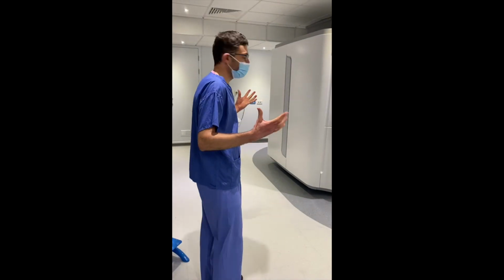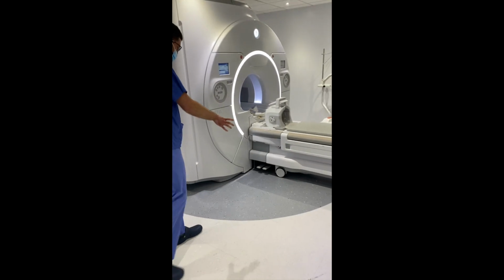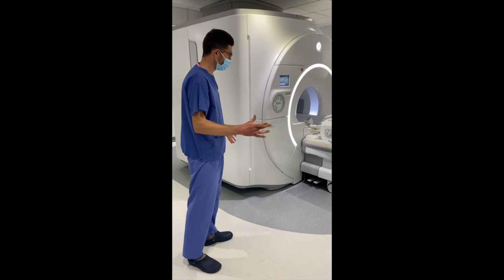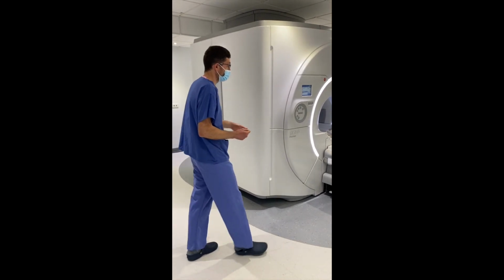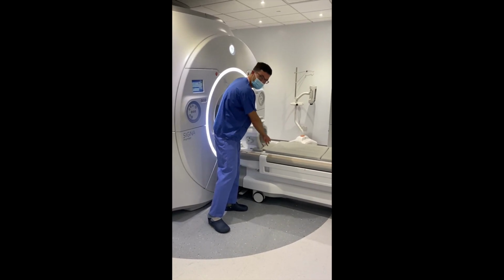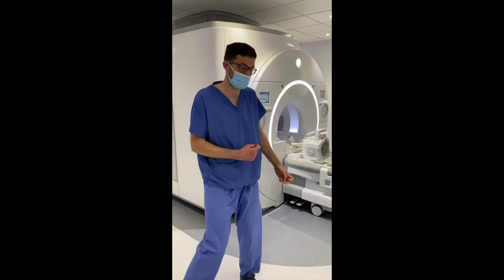So this is the MRI scanner room. This is the anaesthetic machine. What's really important in here is that the anaesthetic machine doesn't go inside this grey circle on the floor, because it's attracted to the magnet once it's inside there and starts to move towards the patient. The other thing to bear in mind when you're putting a patient on the table is the cage over their head. So if they've got an ET tube in, then you'll need to bear that in mind when positioning the patient, but the radiographers will help you with that.